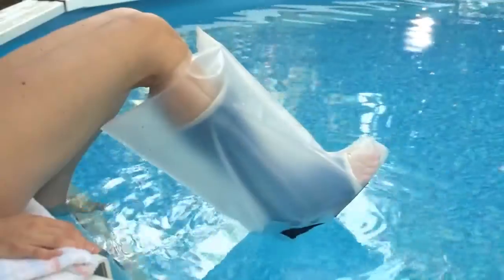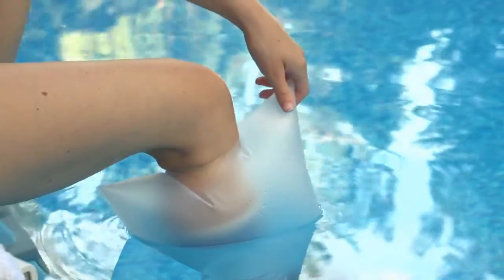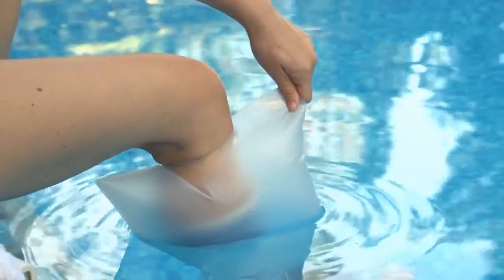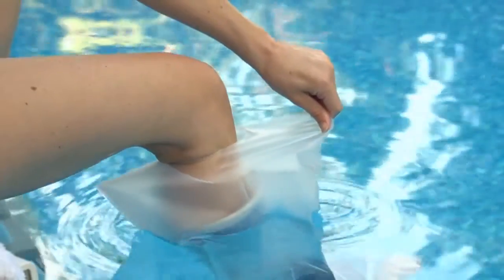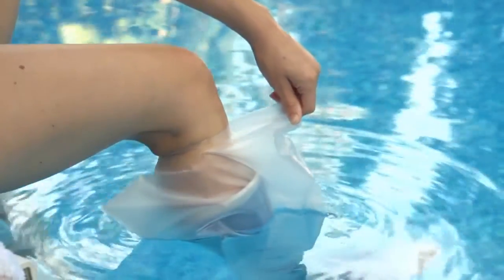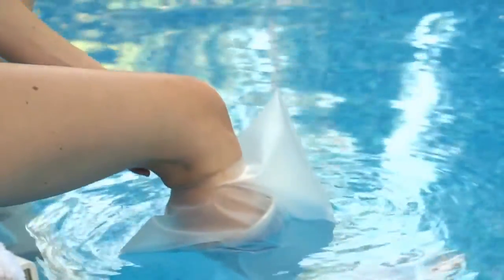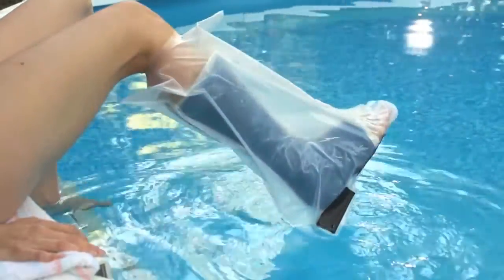To bathe or otherwise submerge your leg, lower your leg into the water part way. Air inside is forced to the top. Pull AquaShield's corner to release the air. As the plastic shrinks back onto your limb, the effect is similar to a vacuum seal. Smooth the seal all the way around and you can now safely submerge your leg.